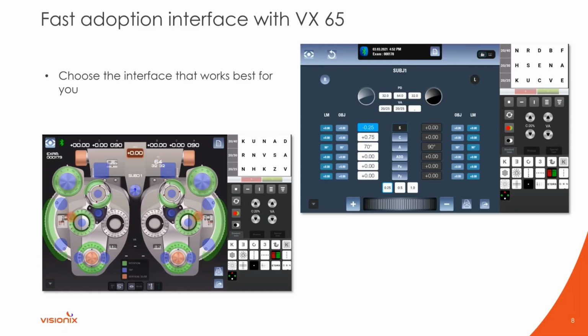You have the ability to use the old school phoropter or a more modern display. On top of that, each doctor can preset the flow of their exam. As an example, I like to do the split prism during JCC or fine-tuning the astigmatism, and my wife likes to flip back and forth with plus minus.